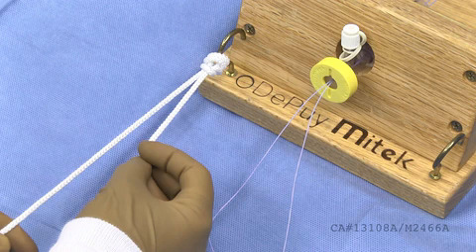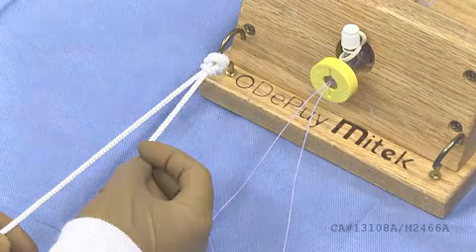Of course, this is not necessary if you are tying a sliding locking knot, which we will demonstrate later. As always, consult your attending physician to determine techniques needed.